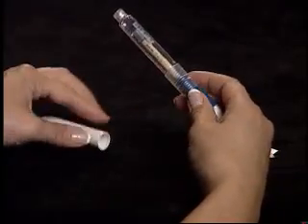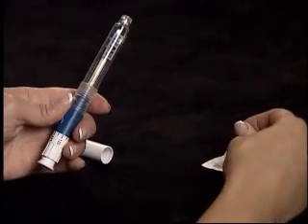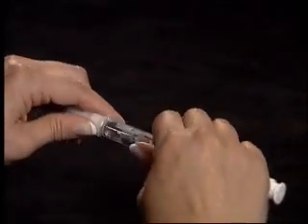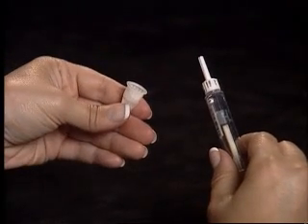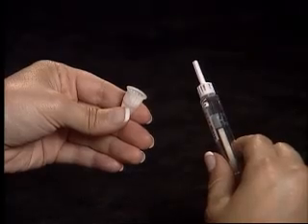Remove the pen cap and clean the threaded end with an alcohol wipe. Attach the pen needle and twist into place. Remove the outer needle cap and do not discard — you will need this cover to remove the needle when the injection is complete.